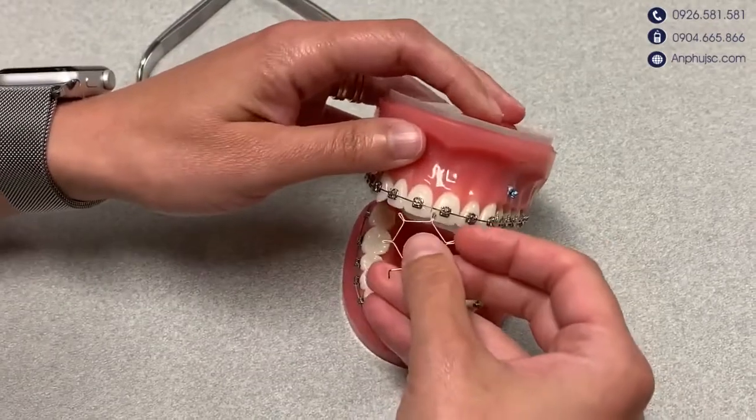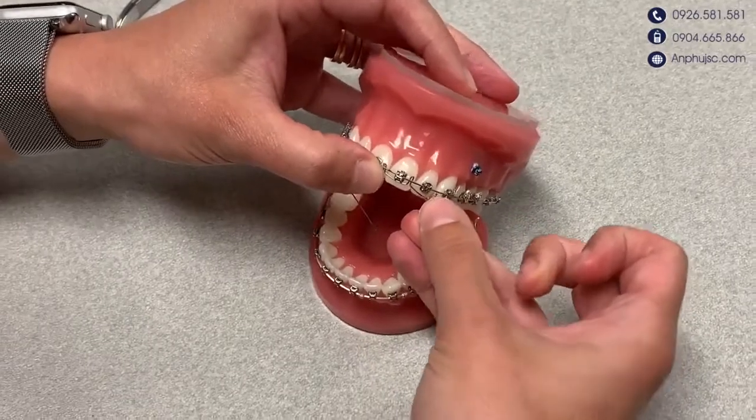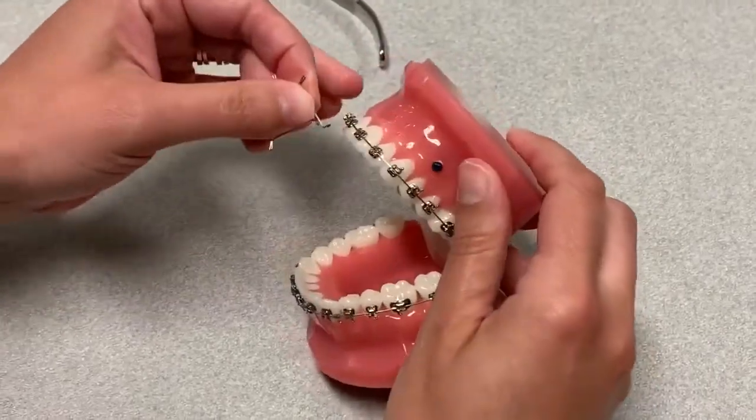So in this case, once this is installed, it's going to look like this. For the uppers, you always hook distal to the fours.